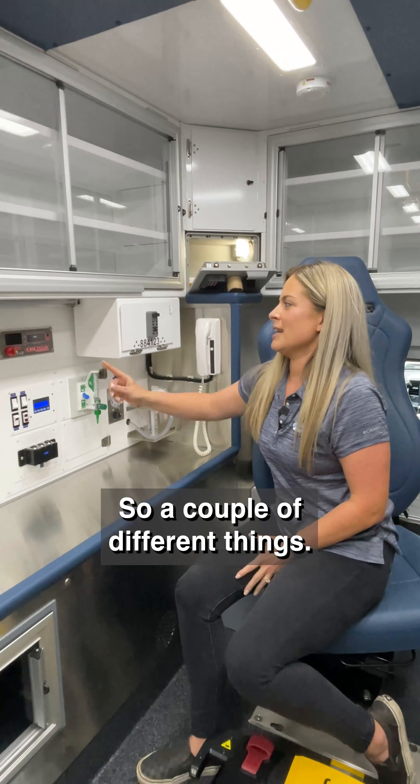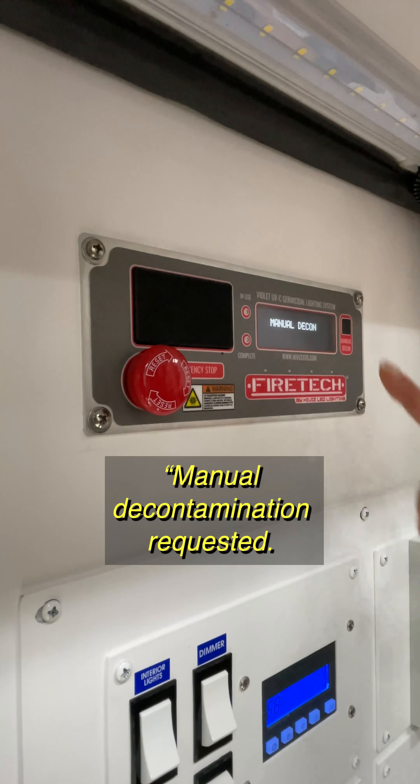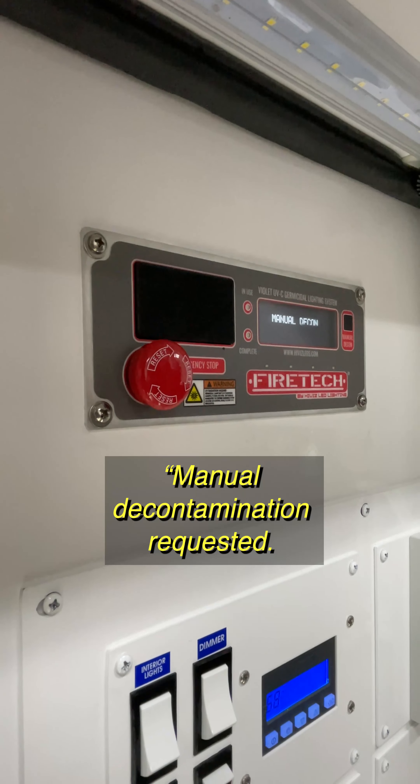So safety — how do I not get cooked back here? There is a speaker here at the control head, so the system will talk to you to let you know that she's about to decon: 'Manual decontamination requested. Exit patient module now.' And there are a couple different timers that will start, so it's not going to automatically turn on. If that does happen, there is an emergency stop here, so whoever's back here can just press that button and the system will stop.